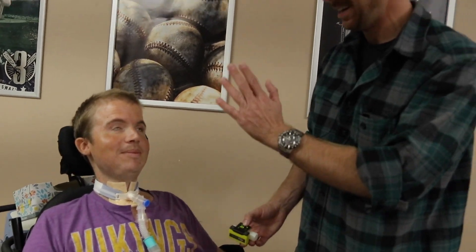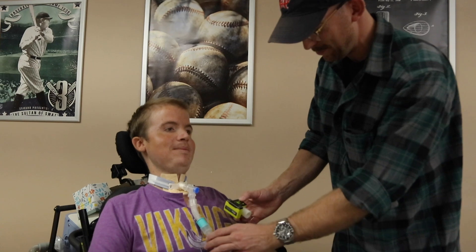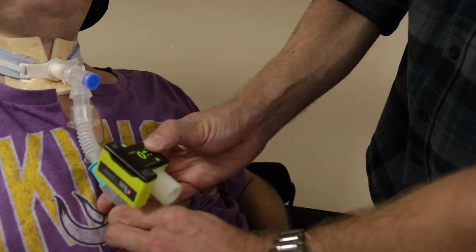All right, so here we've got Brock. Say hi, Brock. Hi. That's me. And I've got the Massimo Emma here. I'm going to try putting this on his vent circuit because he's kind enough to allow me.